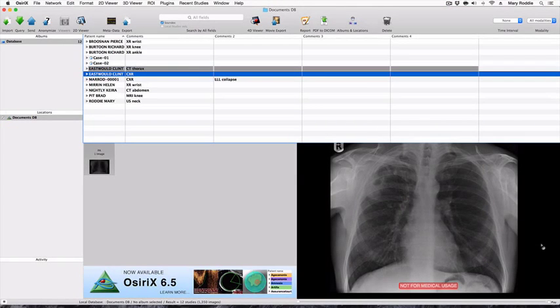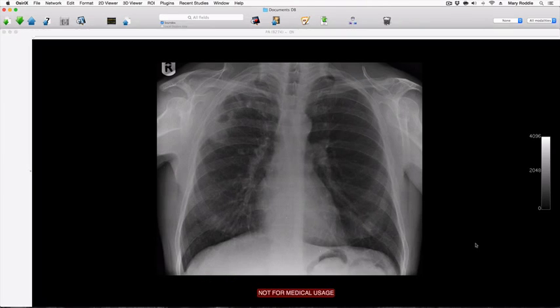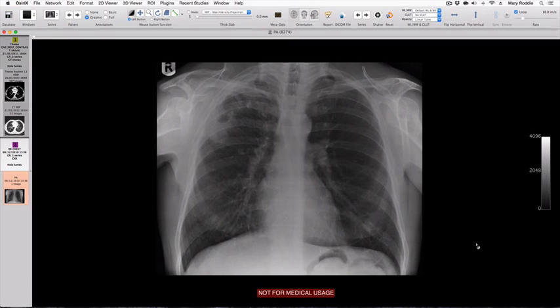One of the things you'll notice when you're using OSIRx Lite — I'm using version 6.5 at the time of recording — is that all your images will have a 'Not For Medical Usage' logo.